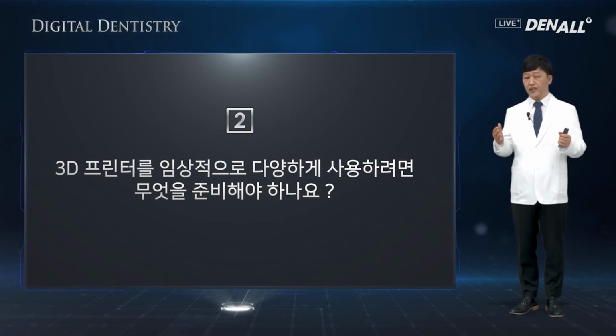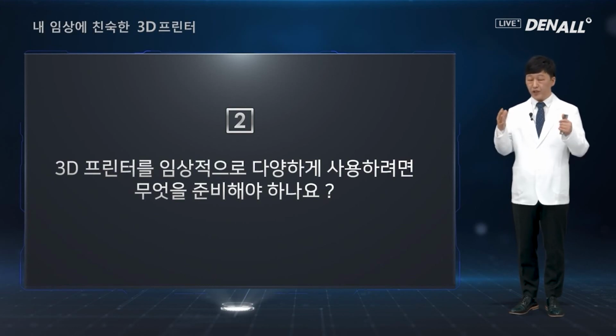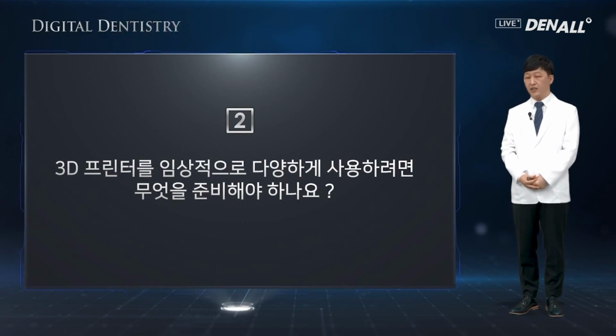So if you have a design program for an intraoral scanner and a model scanner, all those can be done very easily. But if you do not have the device and you have only the 3D printer, you need to ask a lab to do the design for you, and you can print out the design yourself.